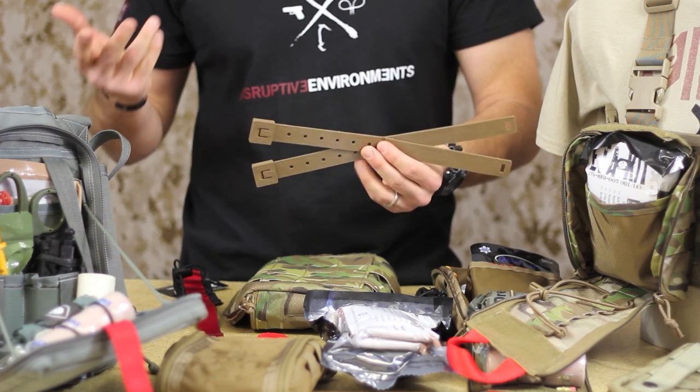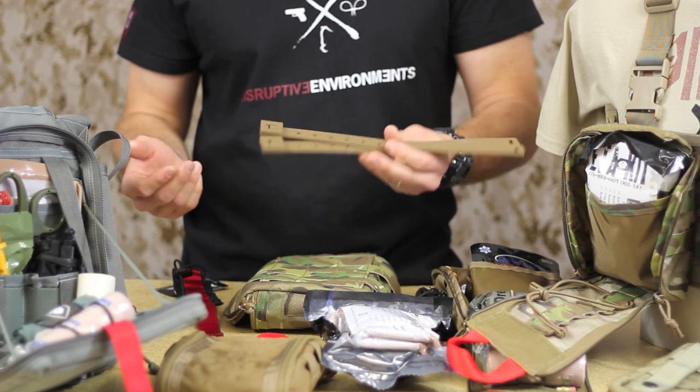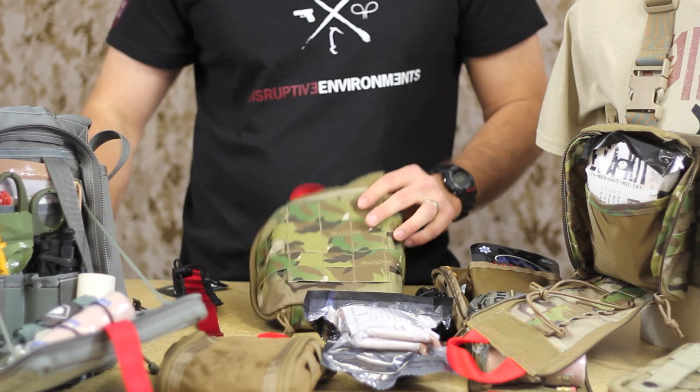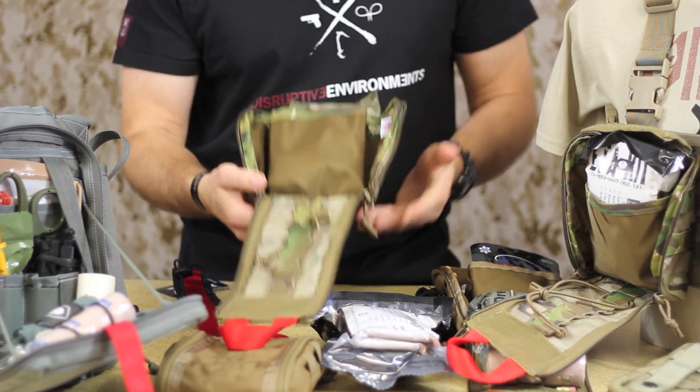We watched a video that Milspec Monkey did on a Tactical Tailor shop tour. They said they've had one or two warranty requests on these things since they've been making them for years, and they've churned out tons of these. So these are definitely proven. That's the attachment system we went with — the malice clips.